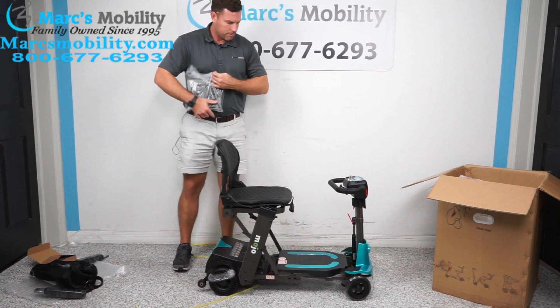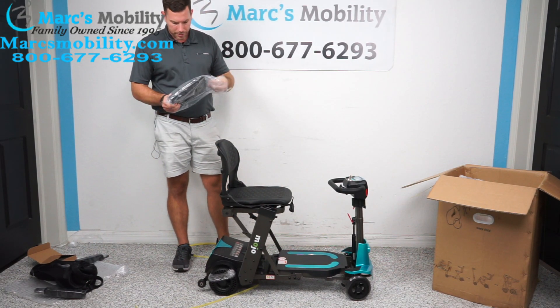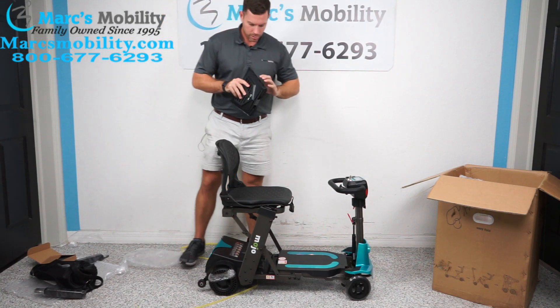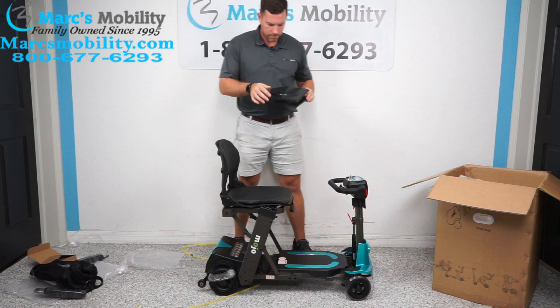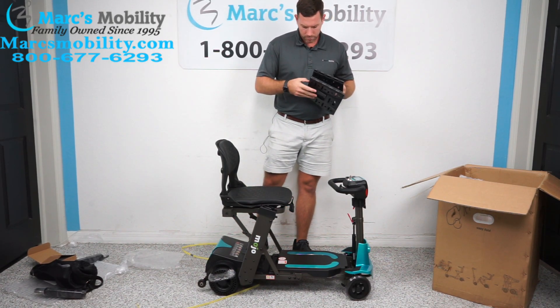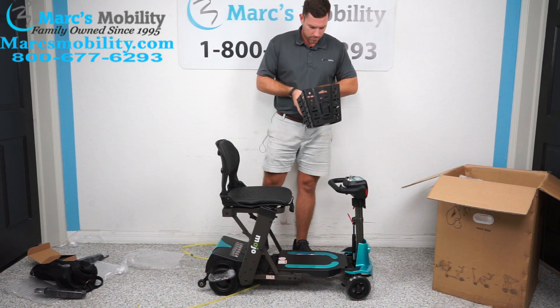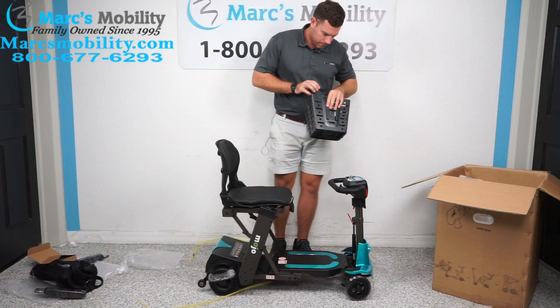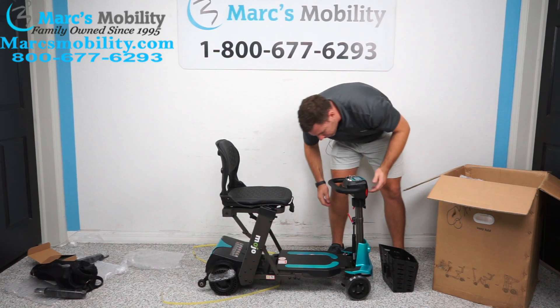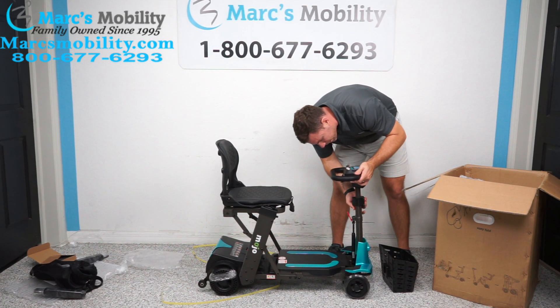It does come with a front basket. We'll take our basket and figure out how it mounts. In order to mount the basket, you have to raise the tiller up.